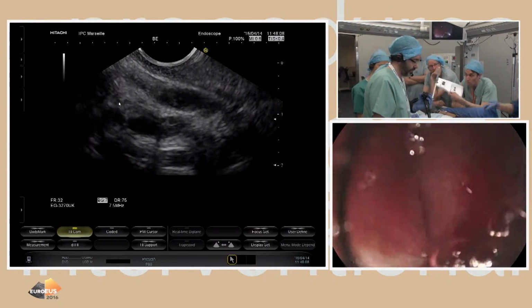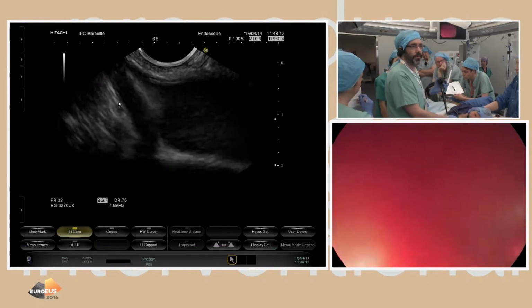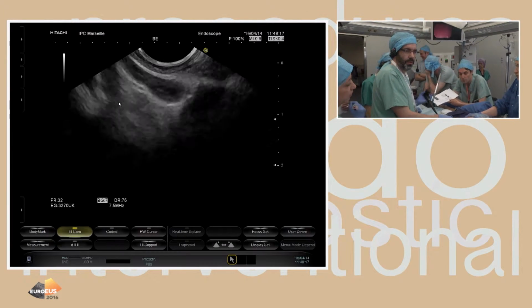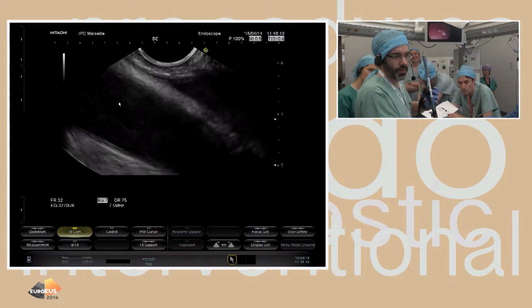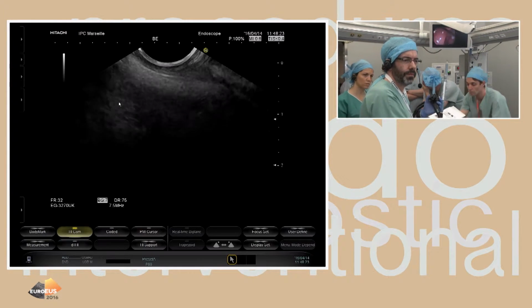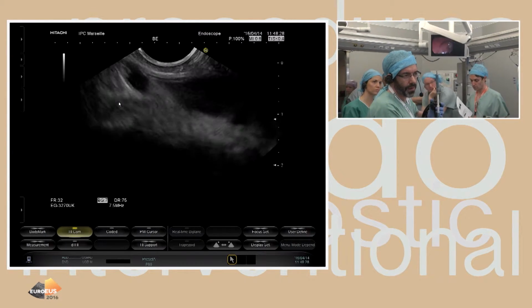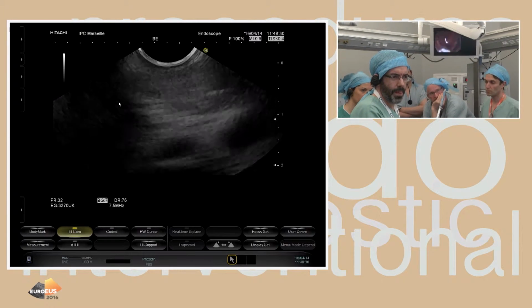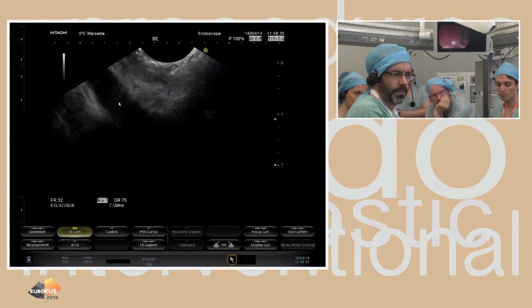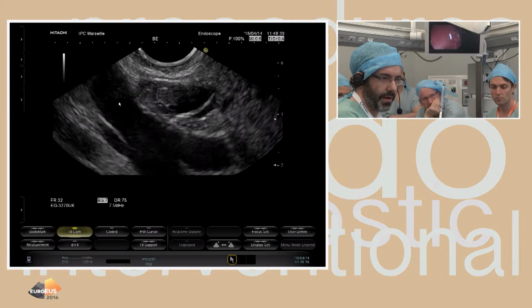Okay. On a 5 minutes de retard. On est en retard. Okay. It's okay, it's okay. Okay. So we will try to find the lesion again. Okay. So here we are.